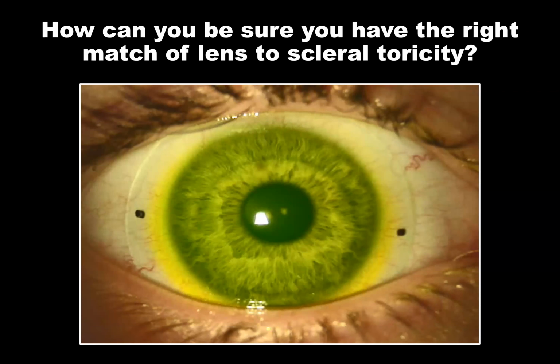So the axis of the markers and the axis of the cylinder are often going to be different points. So the first thing you want to tell Spectrum when you need a front toric is, what axis do these markers sit at? It's not, do we have 10 degrees of counterclockwise or 30 degrees of clockwise rotation? That doesn't matter. What matters is these markers are sitting at axis 175. We want to tell that to Spectrum.